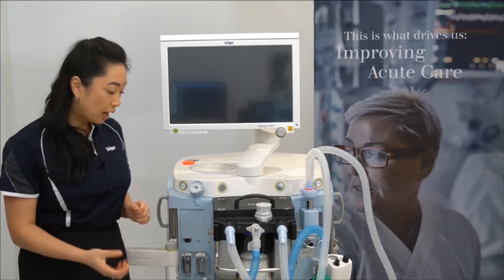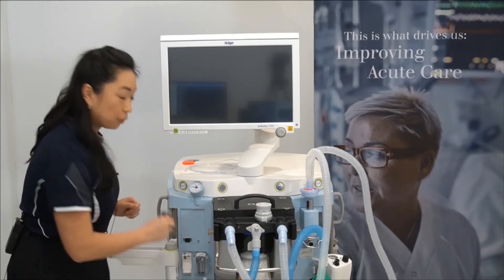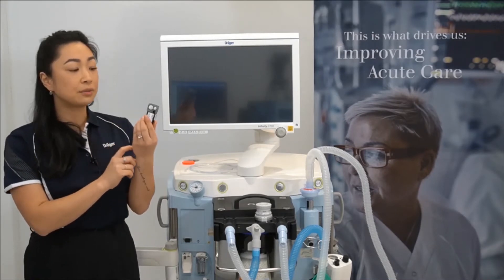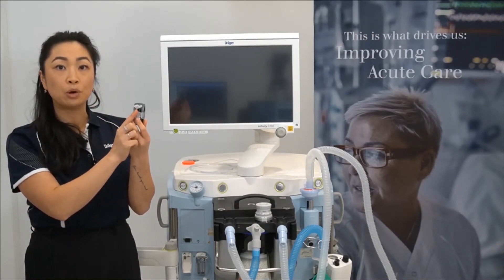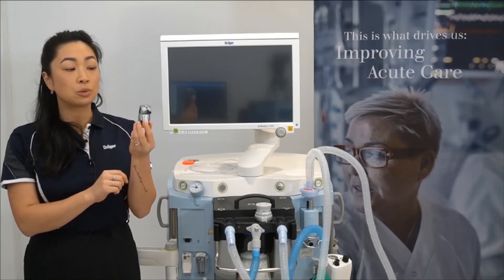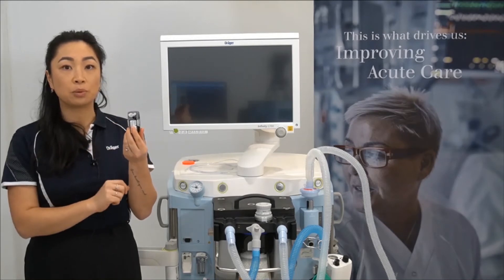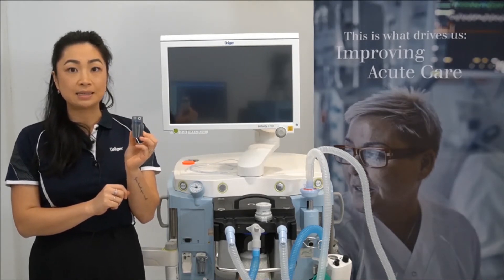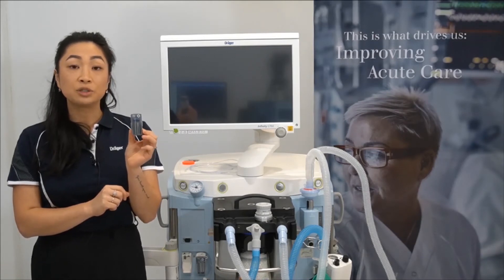To remove the water trap, squeeze the clips and pull it out. If you notice fluid accumulation, a slip syringe can be placed into the black port and removed. If the water trap becomes blocked for any reason, you will notice discoloration of the top ports.